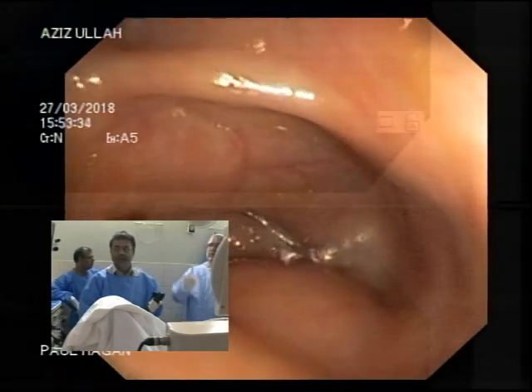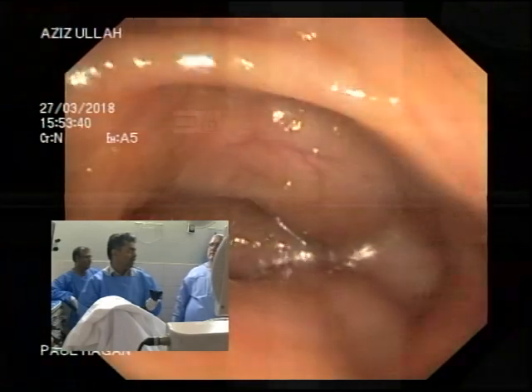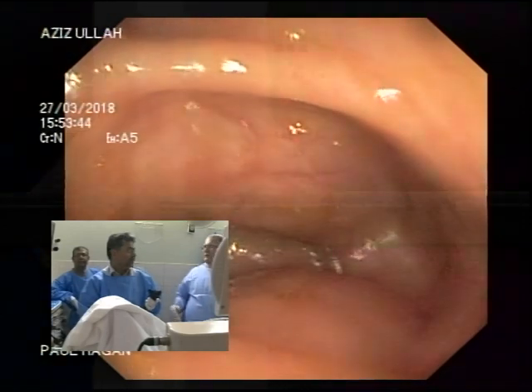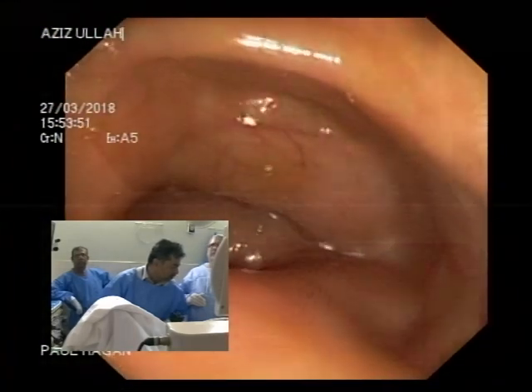So as we are going in and we are coming out, the scope is not moving. So we have a loop at the moment? Well, according to the scope guide, we've definitely got a loop. But according to the patient, he's comfortable. Yes, I am. Okay. Koi dard to nahi hua aapko bhi? Koi aur bhari to nahi ho raha pet?